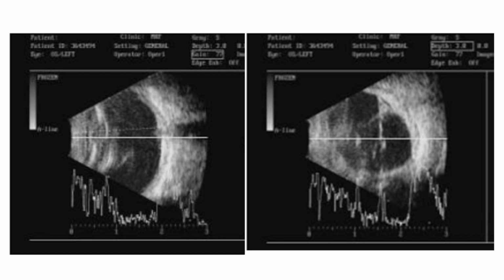So why were you mentioning that the membranes or whatever they are going from the lens to the granuloma? Ma'am, in toxocara, classically the granuloma presents in the periphery. No, you did mention that everything is going from the lens, I'm just curious. No, ma'am. I wanted to tell that the granuloma was just beneath the lens in the periphery, and the membranes were extending from the granuloma towards the optic disc. You mean to say anteriorly the granuloma and the lens are proximal? That's what you mean to say?